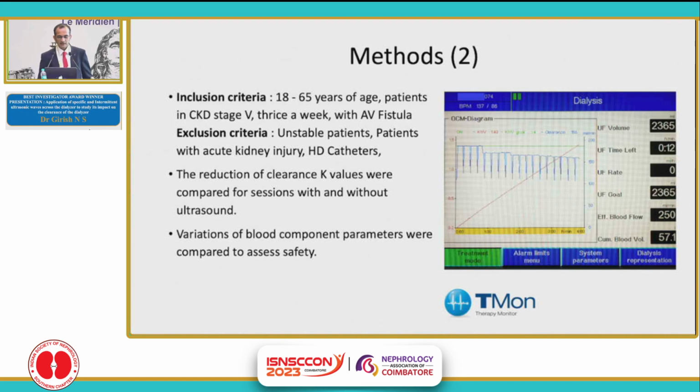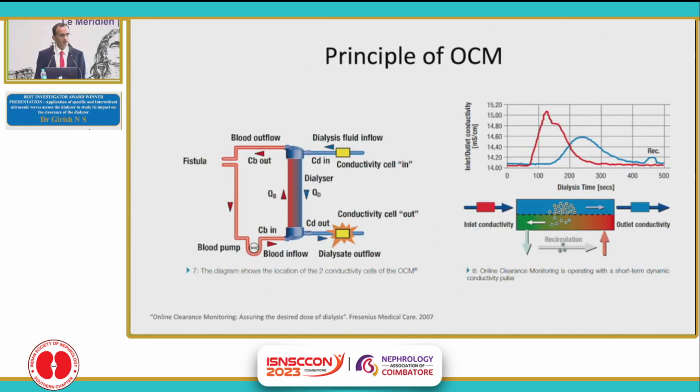This is a pictorial representation of the clearance values. You can see that at the beginning of the session, the dialyzer clearance is well maintained, but as the time progresses, there is a drop in the dialyzer clearance. This is probably attributed to the clogging phenomenon. The principle of OCM works on indirect measurement of urea clearance through ionic dialysance. It measures the movement of sodium, the inlet and the outlet conductivity, and hence we arrive at the urea clearance.